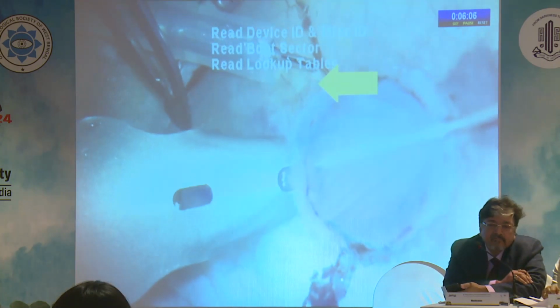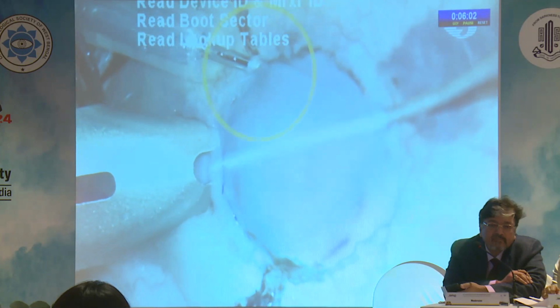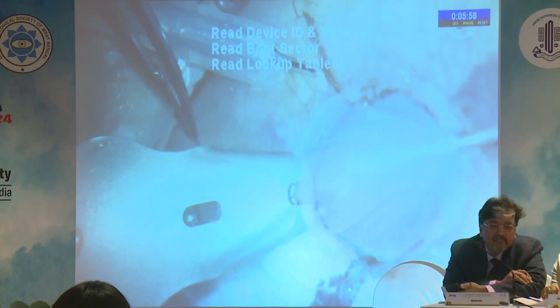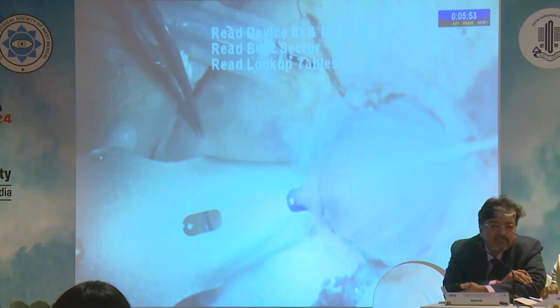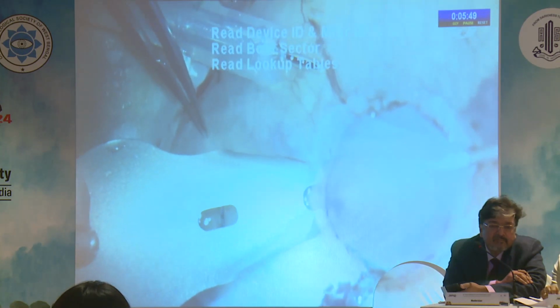Oops, it slides out of the side port. Let's see that again in slow motion. As the AC maintainer slides out, the chamber shallows. At this point, it is important not to panic and to pull the donor lenticule into place.